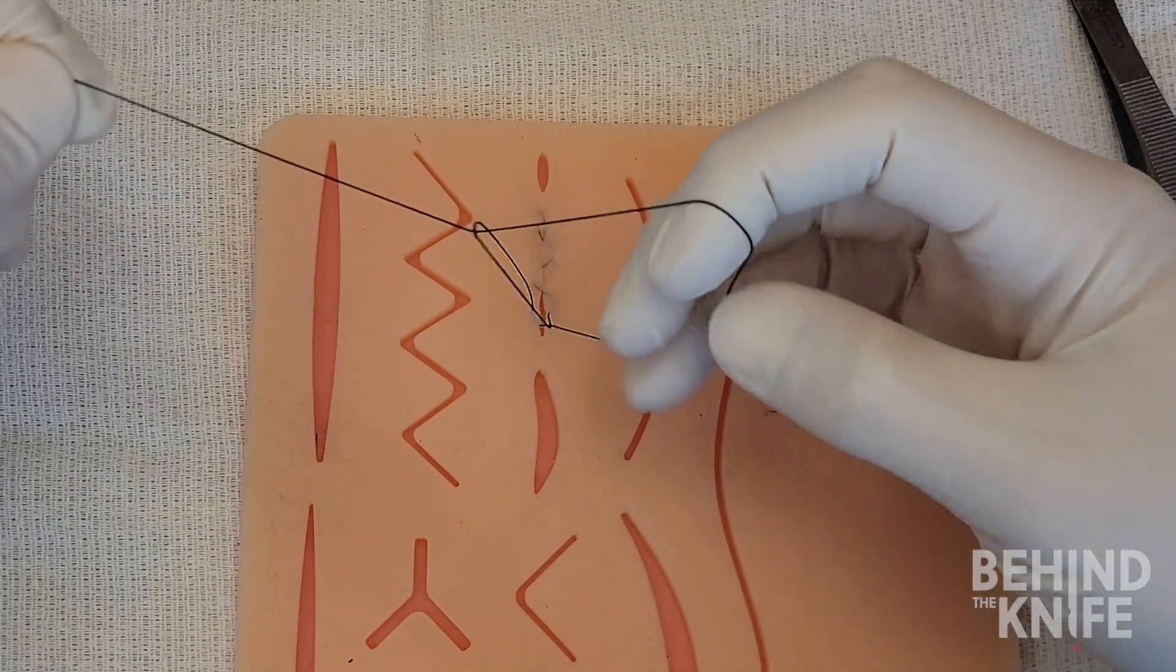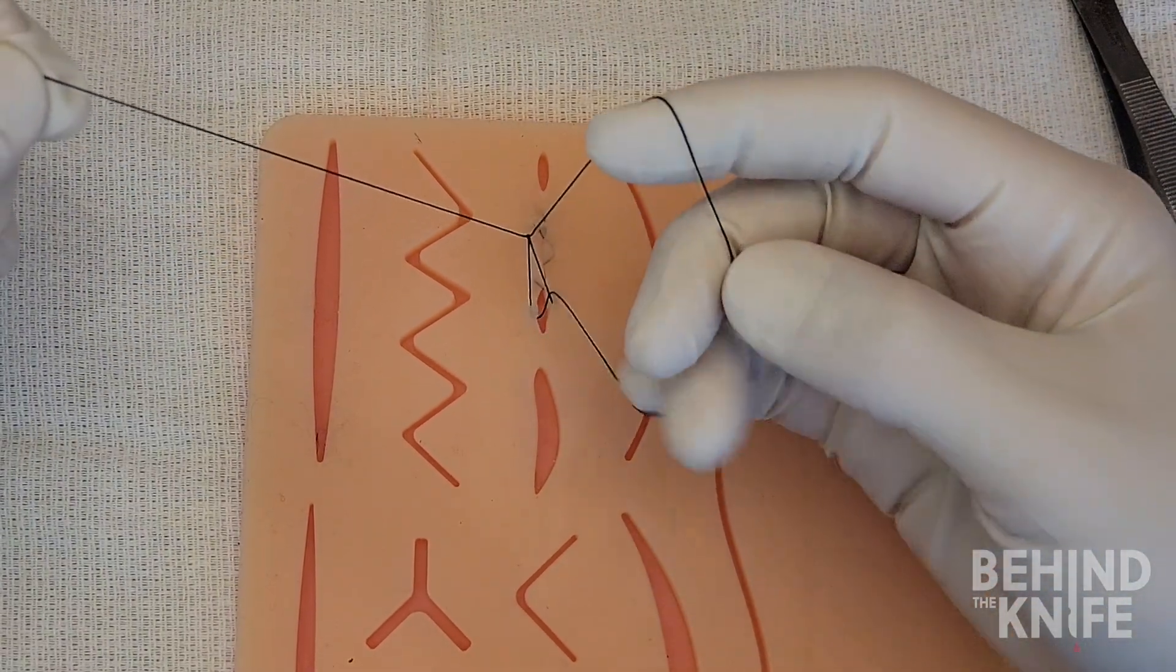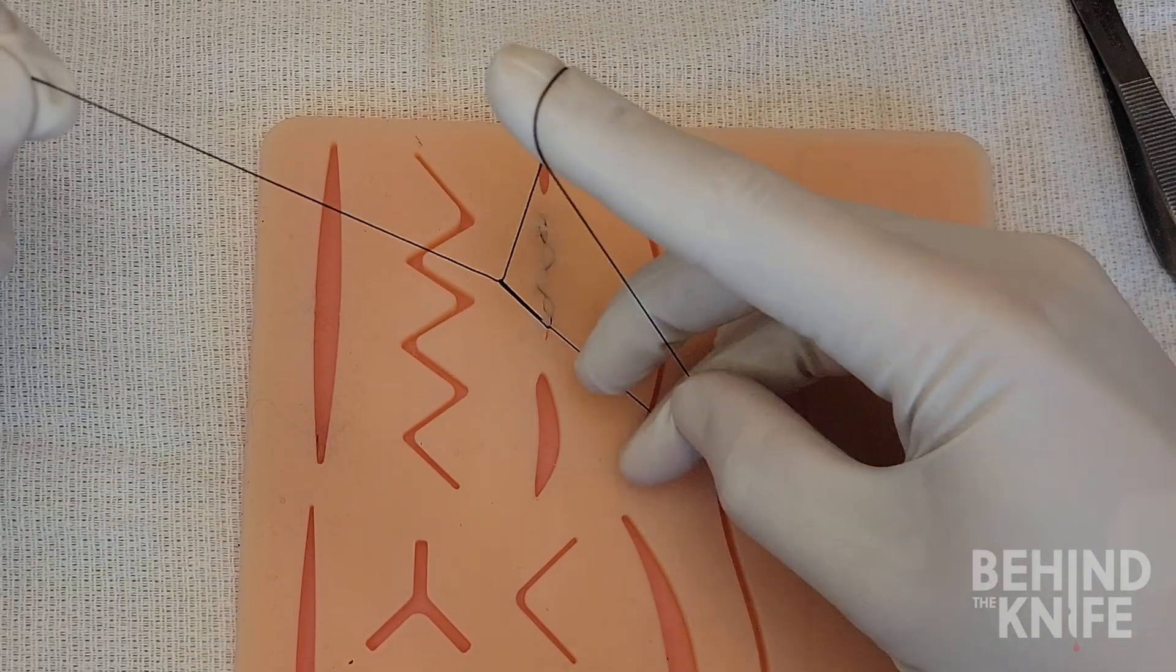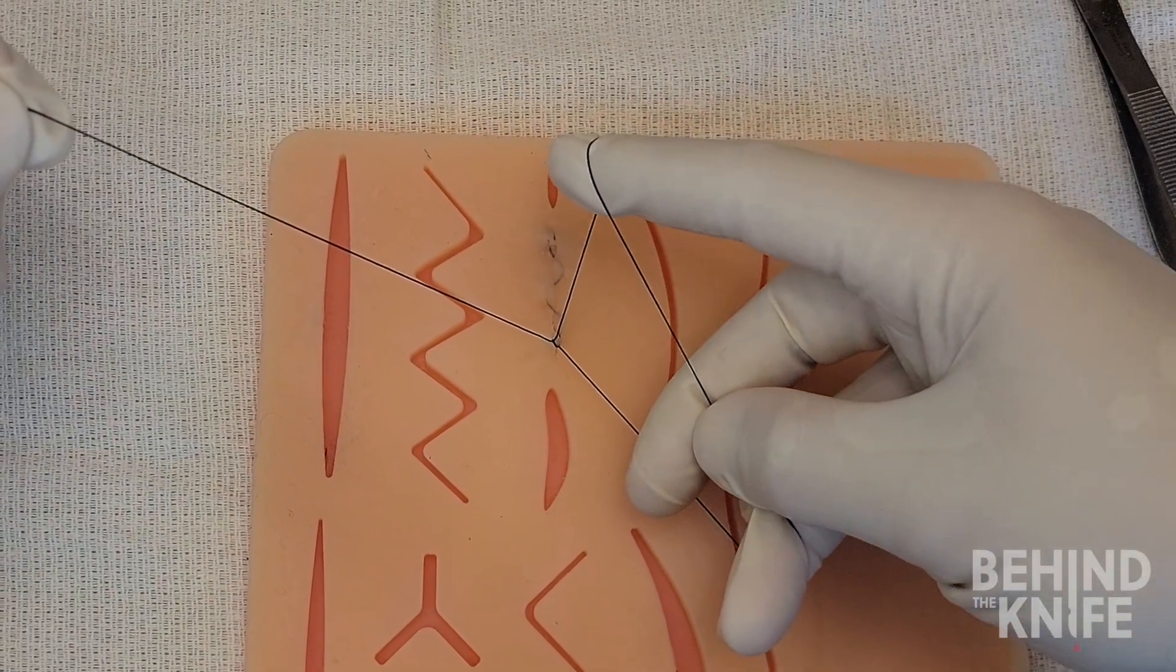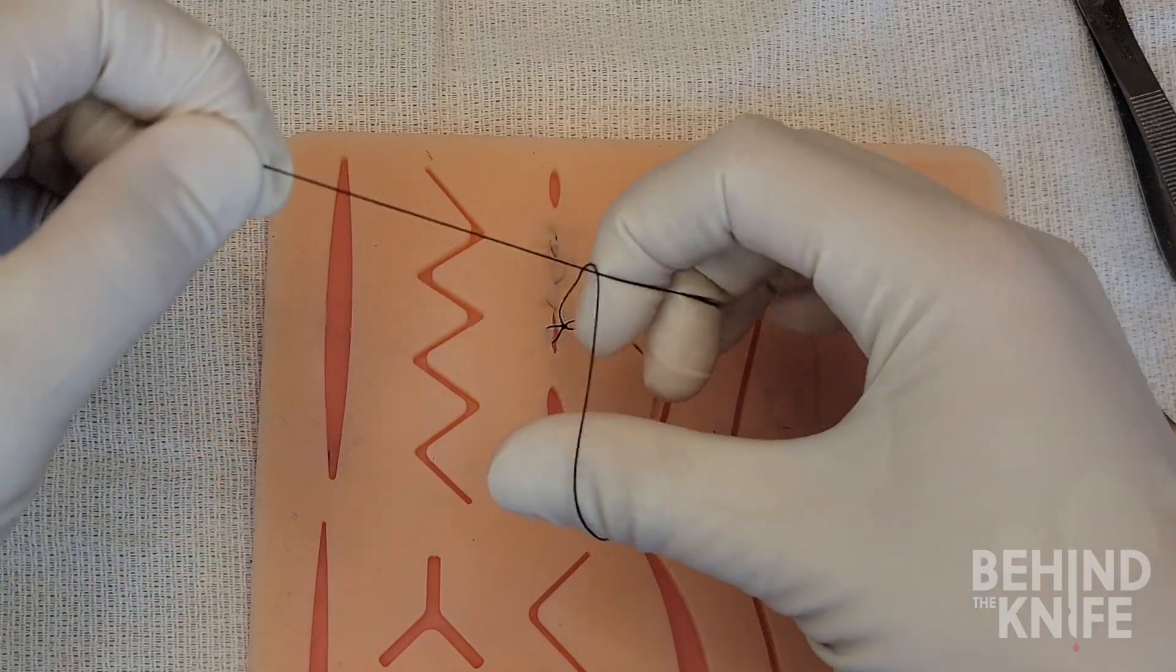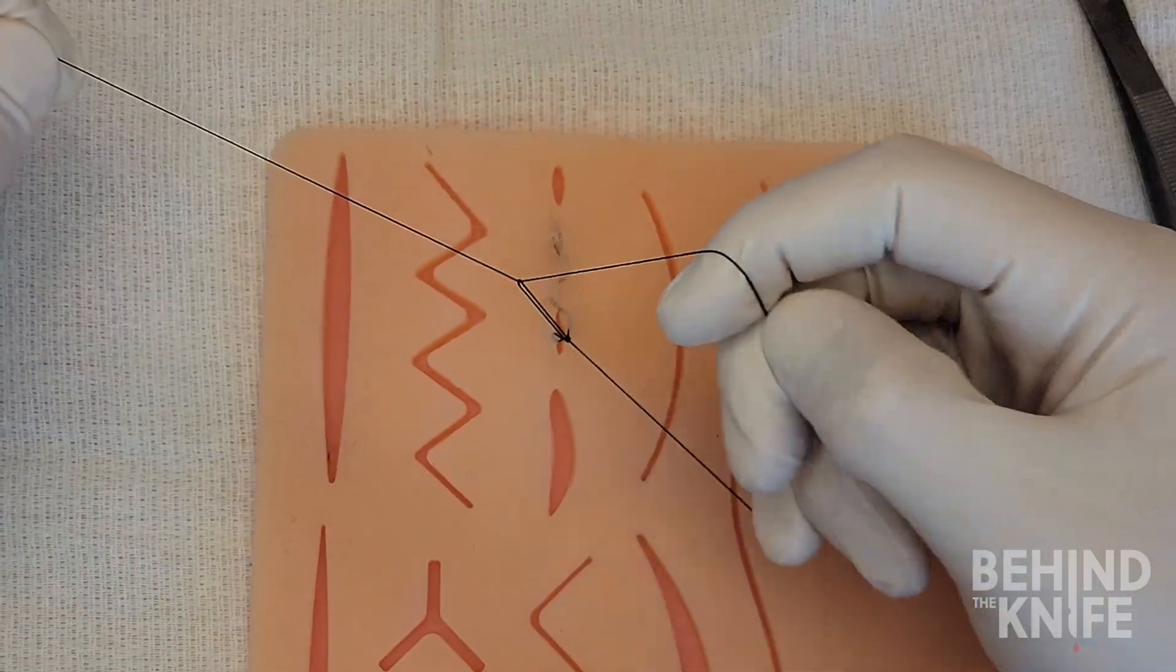To make sure a knot is tight without any slack, it is important to pull the suture in the loop with your right hand until the knot slides all the way down. From here, you can perform this same movement two more times.